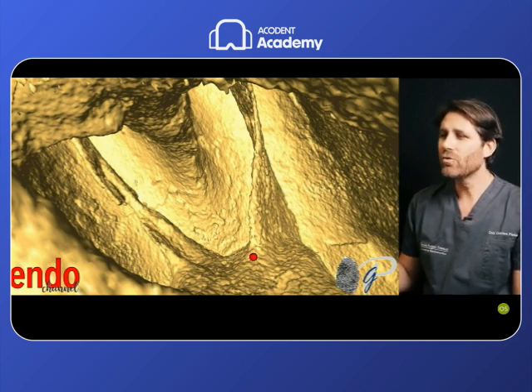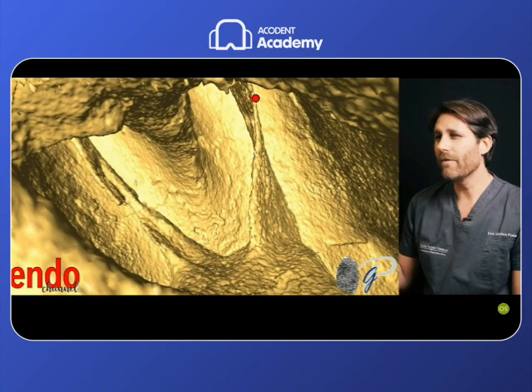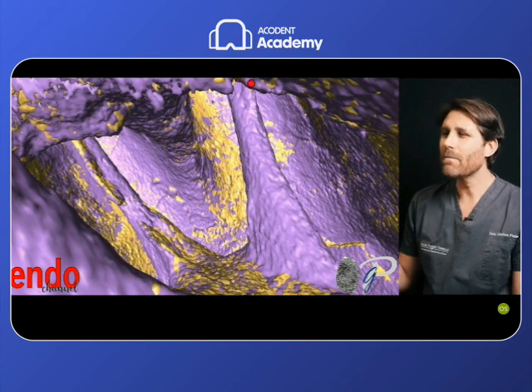The MB2 root canal is moved more towards the center of the pulp chamber floor because of the presence of the dentin here that moves the root canal there. Then the root canal, when we finish the root canal preparation, as we will see here in purple, will be moved onto the same plane of the MB1 root canal after the root canal preparation.